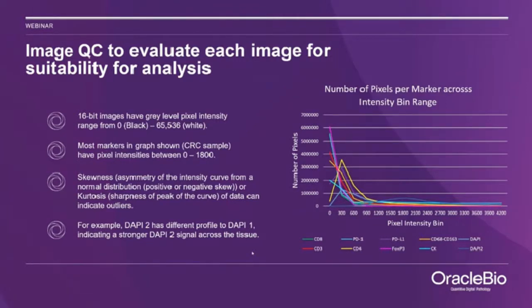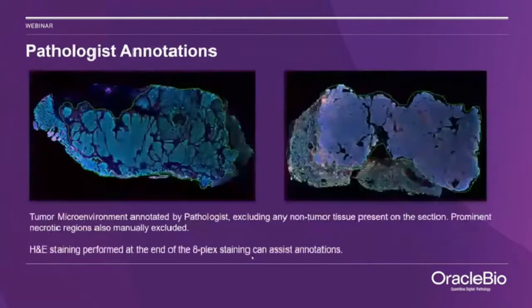The overall purpose of this is to try and move away from a subjective visualization of these stain intensities, and to do a more objective quantification of this process.